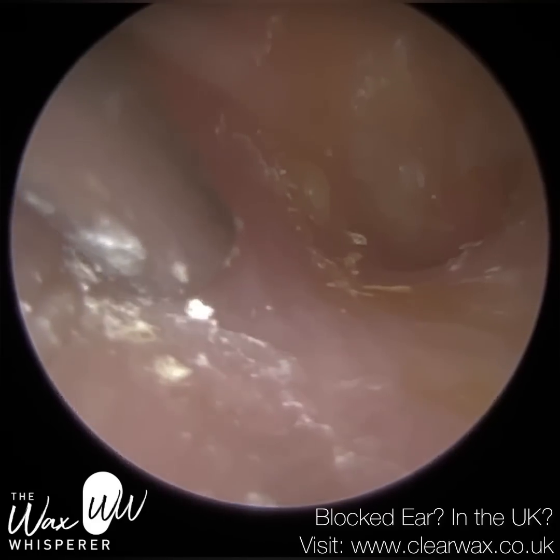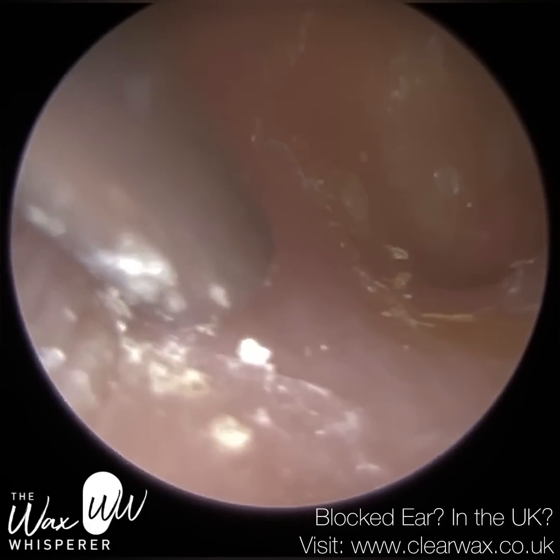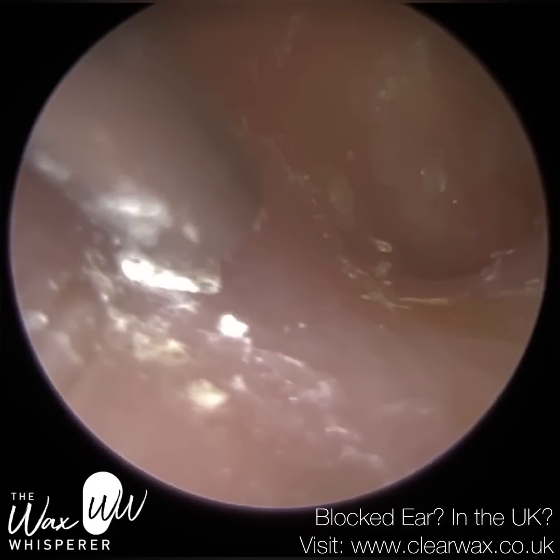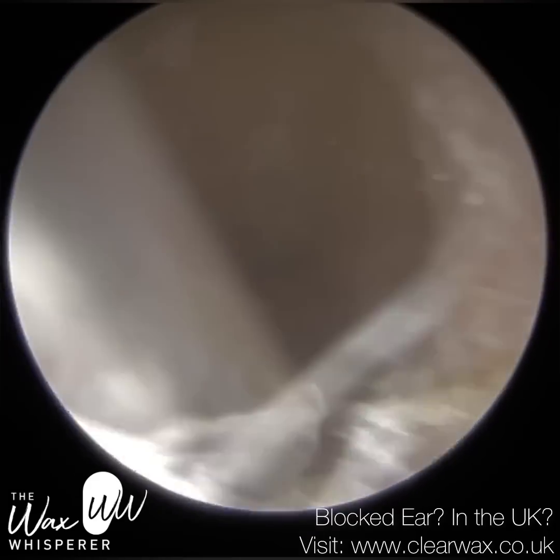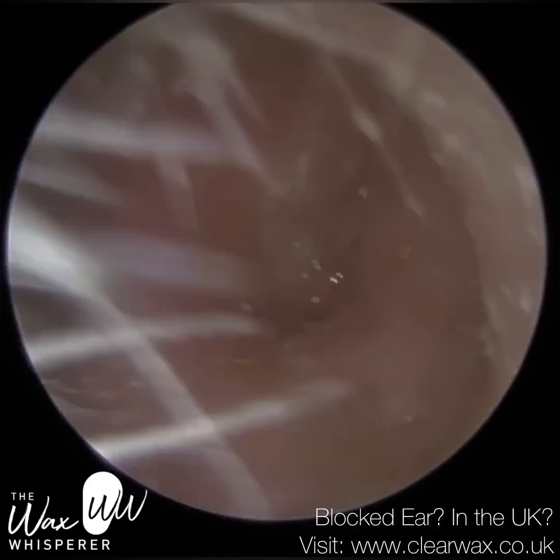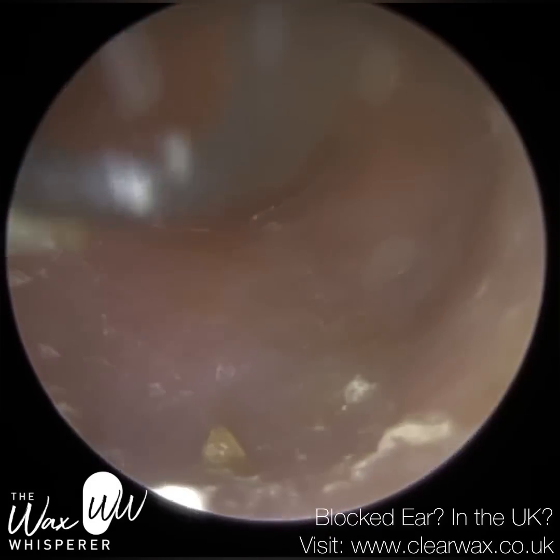And the patient said it looked like tadpoles, and they couldn't watch it. So we airdropped the video, and when they watched it back, they said, no, they can't watch this. It made them a bit nauseous, seeing as it just gave them that appearance of tadpoles behind the eardrum, which is obviously a bit gross. So just mopping up near the entrance here.